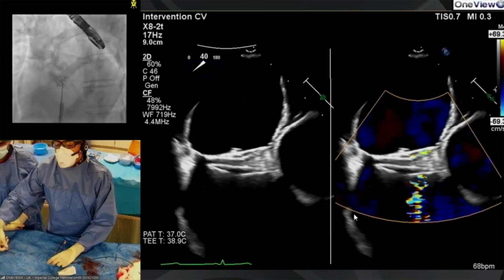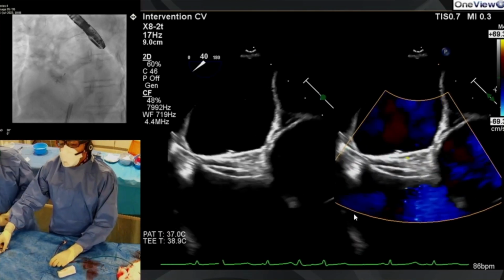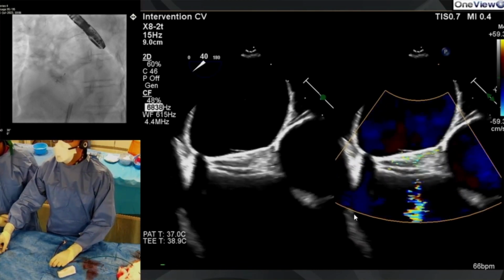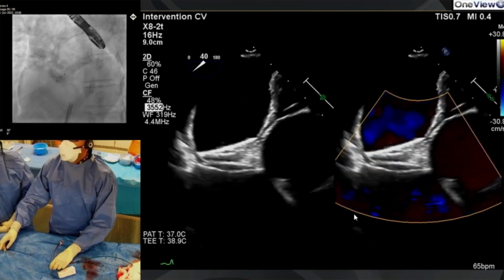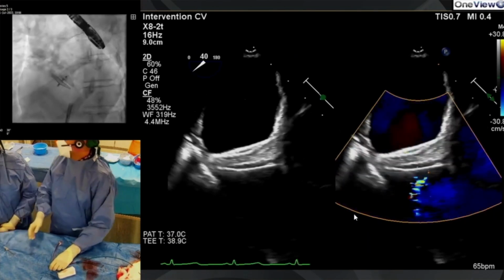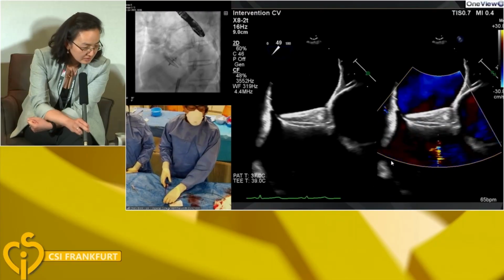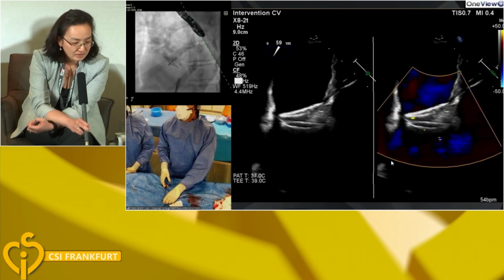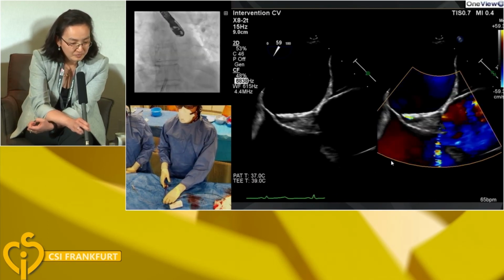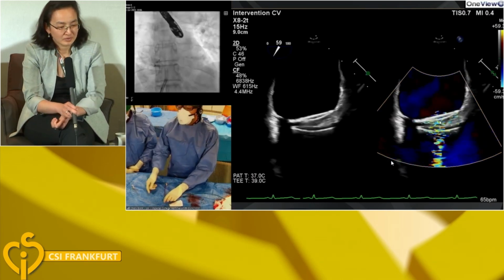So we're just having a bit of a problem with, you see there's a bit of an artifact on the probe, which is a bit disappointing. But I'm just going to turn the scale down as requested. Well, how low should we go? 30? Happy with 30? No, that was good. They wanted the gains lower down. They think it's the gains. No, it's not the gains, I'm afraid. I've just turned the scale down, but sadly it's not the gains, it's the artifact. This is artifact. It's our probe. I think someone's bitten the probe.